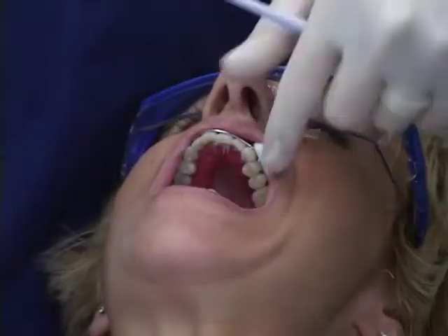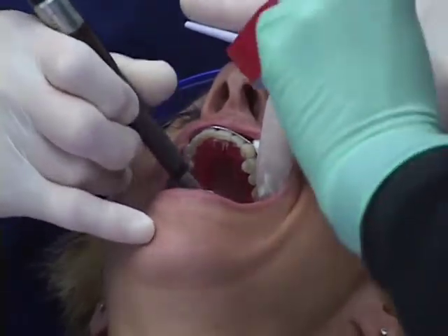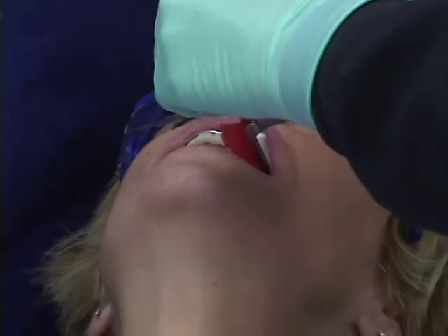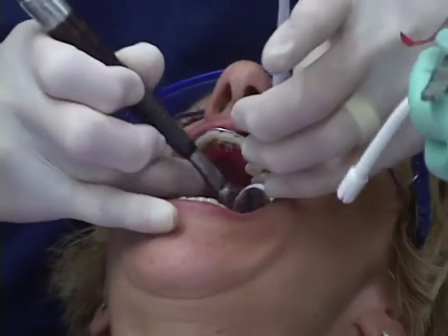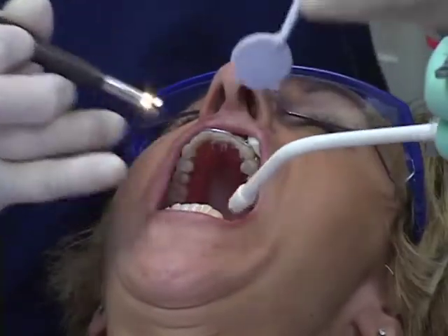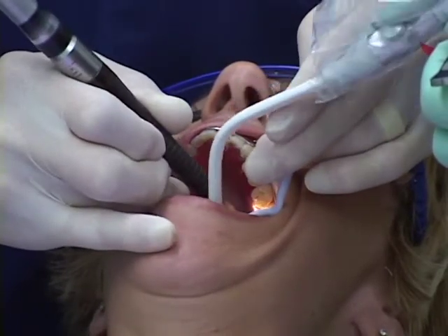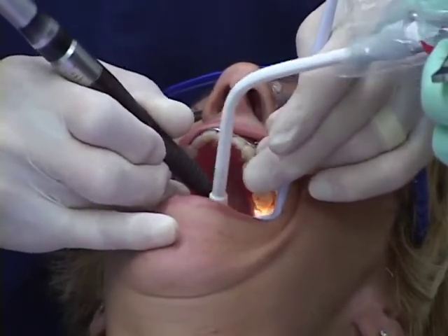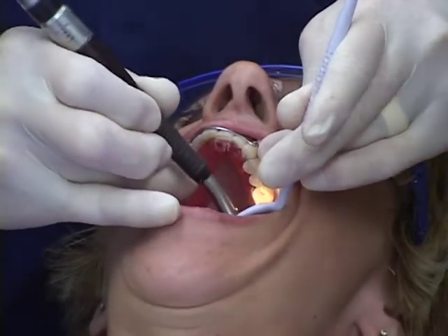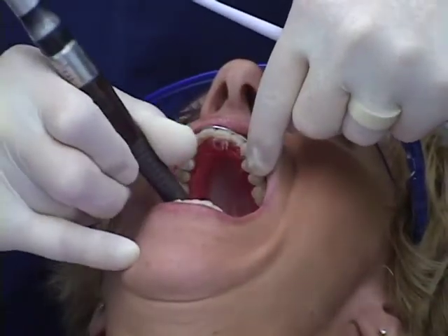Let's put a red on that left, okay? Again, a lot of times I'll just change colors here so you start to get all those marks, and some of them are smudges and not true contacts, and changing colors kind of verifies if they are in fact truly a contact or interference. And I think we're about ready to take our point down again. One more time, actually, I'm going to go one more time. I've got it still pretty heavy.